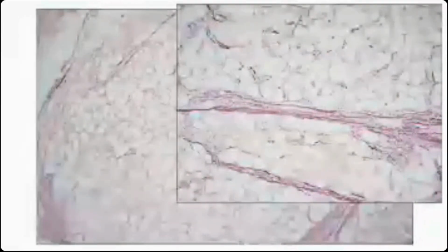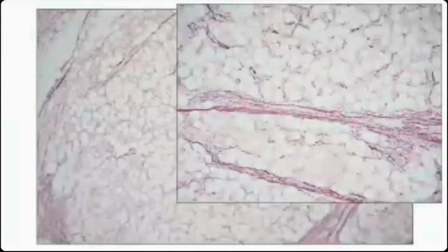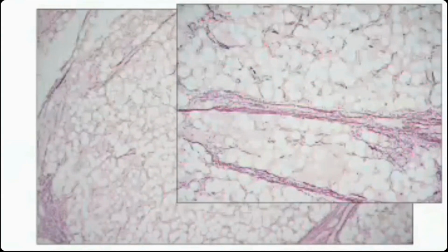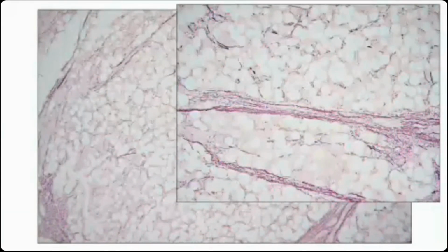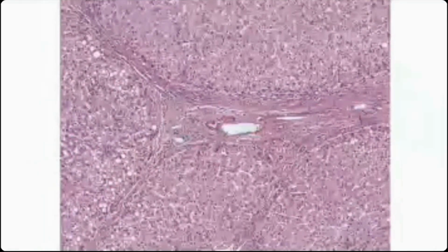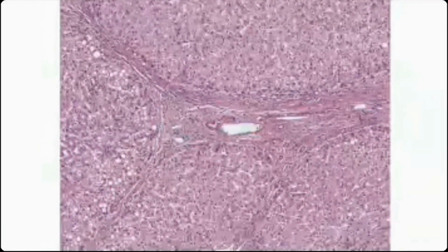Because we've got bile, we know we've got a hepatocellular lesion. We've seen mitotic figures, which are concerning. We've seen nuclear atypia, also concerning. And we've now seen that this patient has reticulin loss within the lesion, which is concerning. So these all amount to, I'm going to give it away on tape, anyway, a diagnosis. The background liver is cirrhotic. We've got nodules of hepatocytes, a mild chronic inflammatory infiltrate and background fat in the background liver.